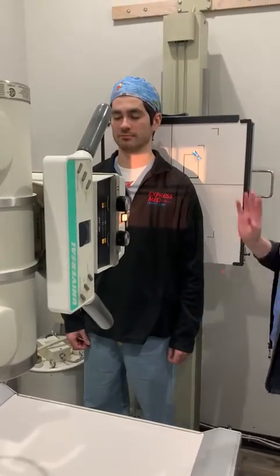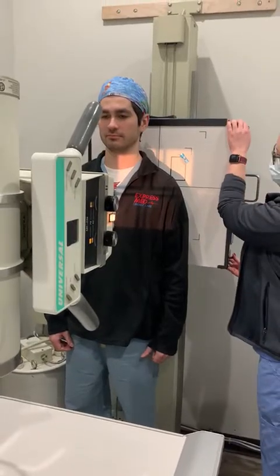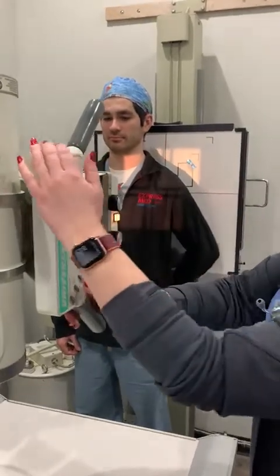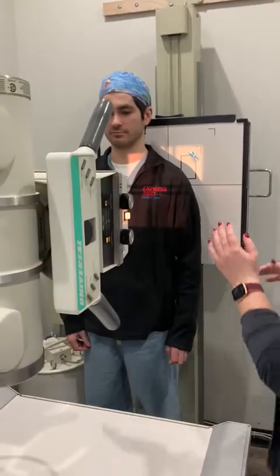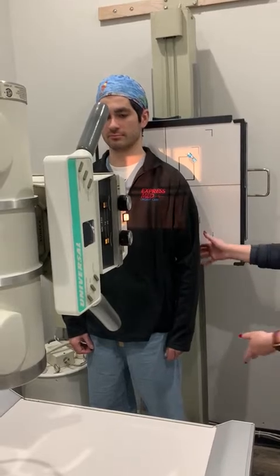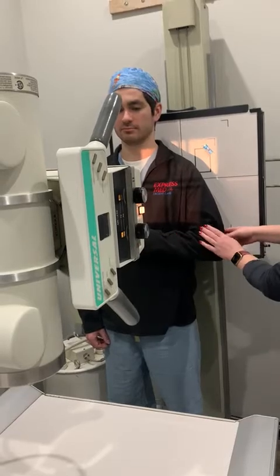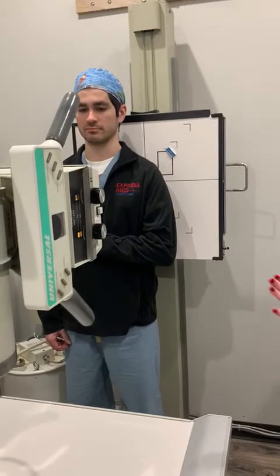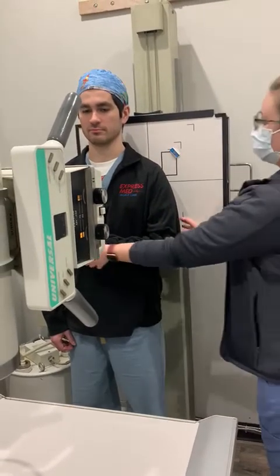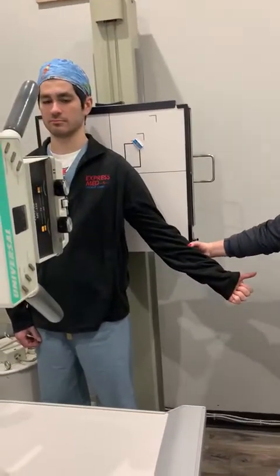We need an internal view and an external view. It doesn't matter which one you do first. What's nice is that the patient stays in the exact same position and just has to move their arms. For the internal view, just put your hand on your belly — go ahead and take that picture. When you come to change out cassettes, tell the patient do not move a muscle. Then for the external view, just have them point their thumb up and out to the side, and take another image.